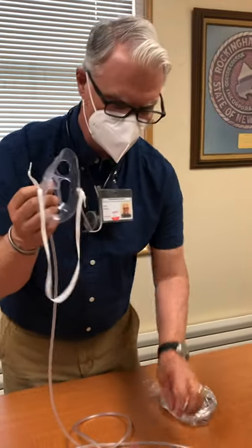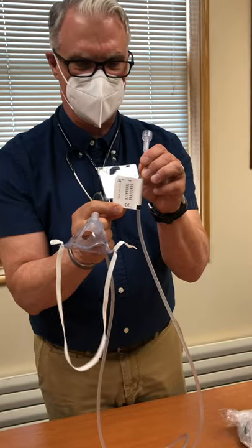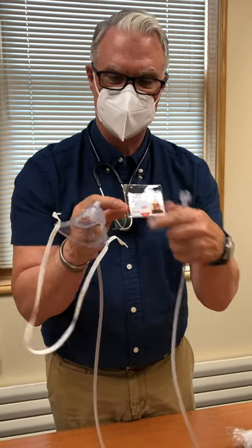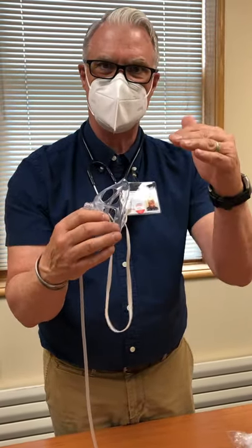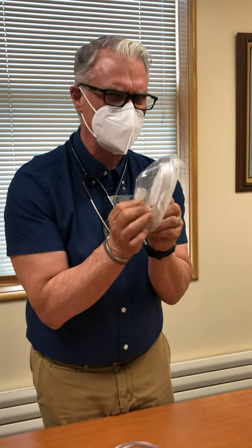Now, if you're interested in FiO2s, there's a little tag on this mask that will tell you what liter flow and what FiO2 you're getting. Personally, I care more about how the patient is saturating. When you use this mask, put it on and titrate your liter flow to keep the patient's sats between 88 and 95.